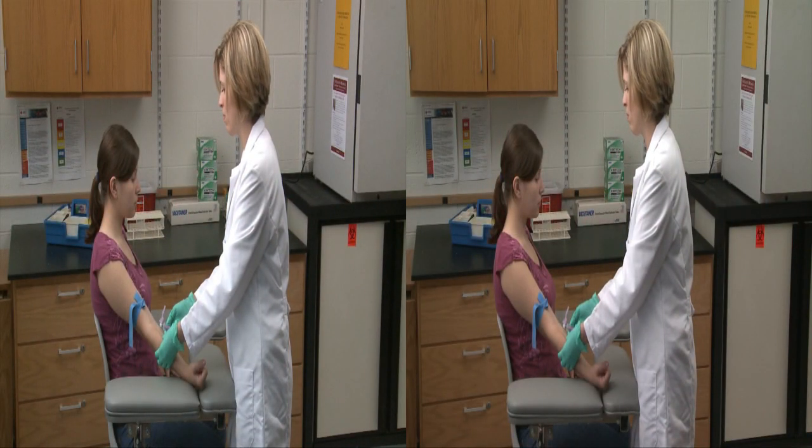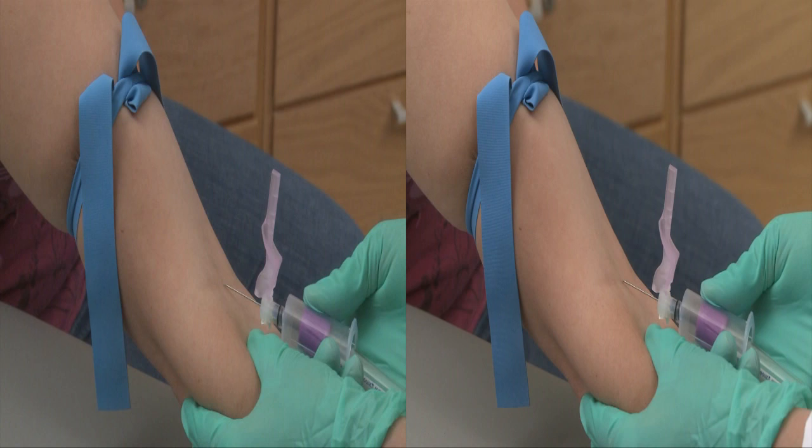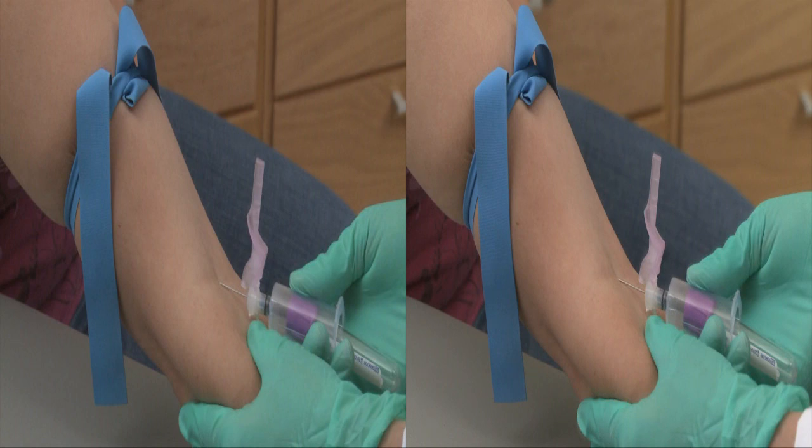You'll feel a slight pinch. Position the needle, bevel side up, and line it up with a vein. Position the needle so that it forms a 30-degree angle with the surface of the arm. With a single, short, but firm motion, swiftly insert the needle through the skin and into the vein.